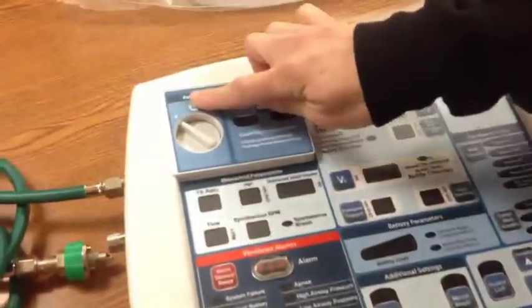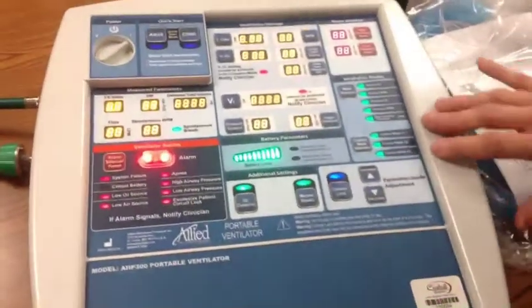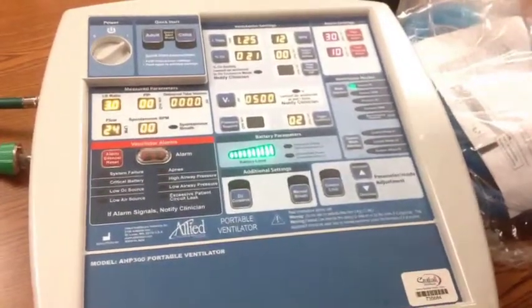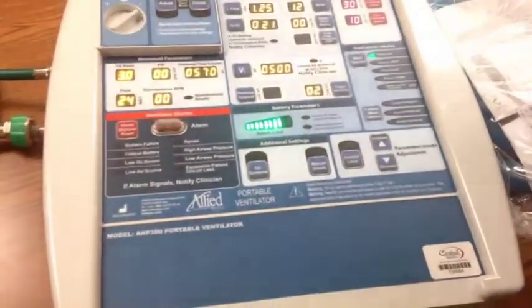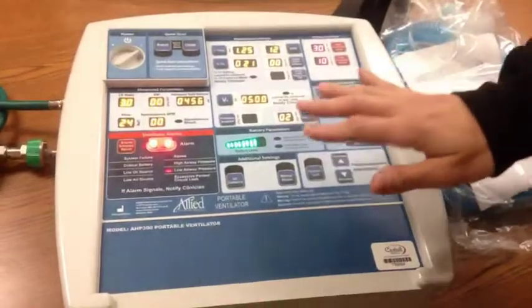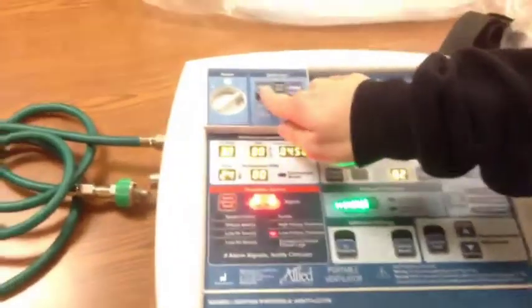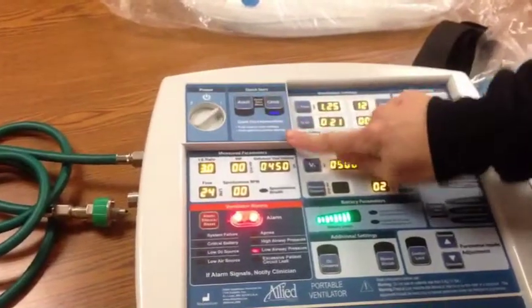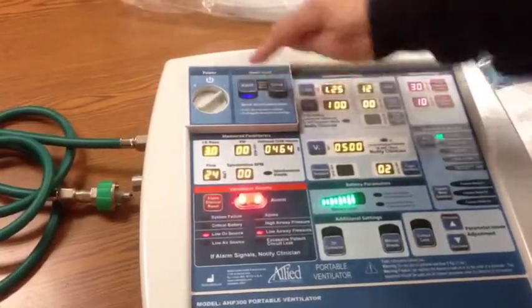To turn this on, it's a slide dial. Power, turn it all the way to the right. Now the nice thing about this vent is that it is pre-programmed with our settings for adult and child. They're the most popular settings that we will come across in the realm of the SCTU transport. There you go. If you want to change any of these settings, then you want to make sure you either select the adult or the child. Anytime you press a button in and it blinks, you push it again to lock it in.